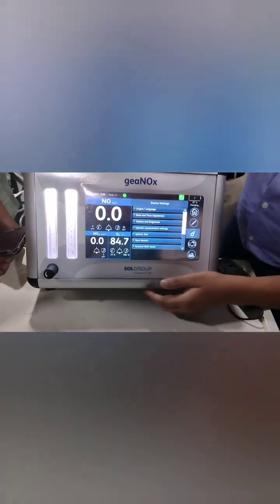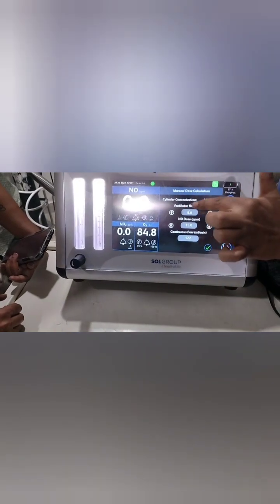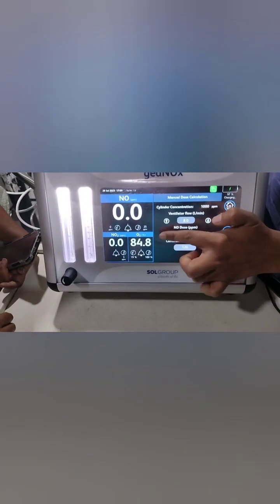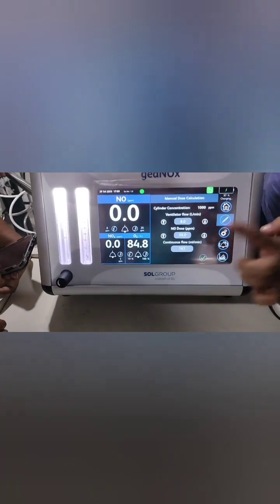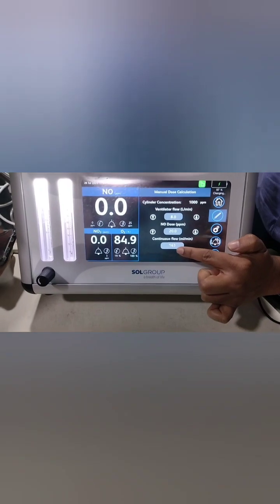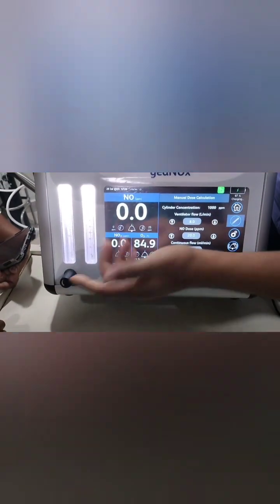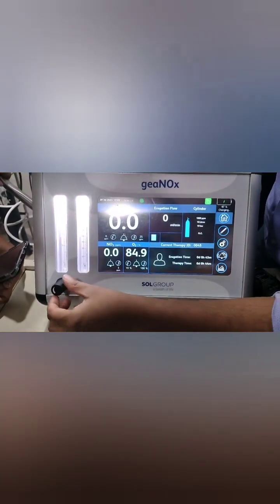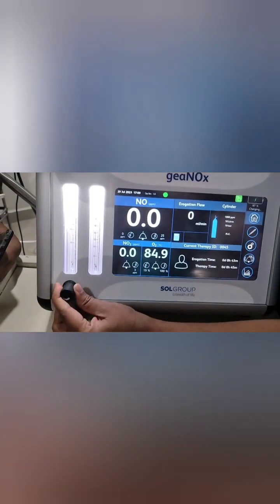How do you know how to deliver 20 ppm? There is a calculator button. You enter the ventilator flow — for example, 8 LPM — press enter, then enter the target ppm, usually 20 ppm. It will calculate the required iNO flow — for example, 163 mL/min — and by adjusting the knob you can set it to around 160.